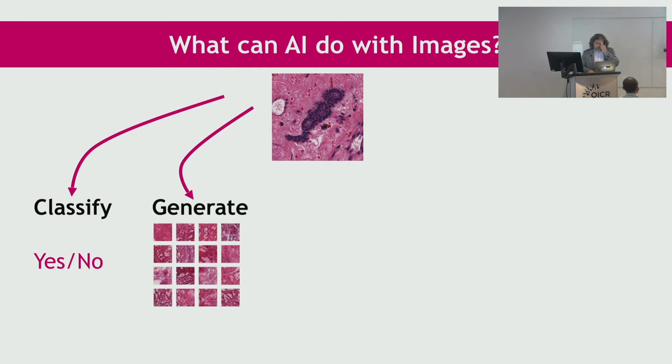Of course, we can also use AI techniques to generate images, basically fake images. And as much as that's disturbing in the personal domain, that you can, I don't know, make old paintings laugh and talk and so on, in medical images it could be a blessing. We can create synthetic images. That's a new way of creating phantom images.